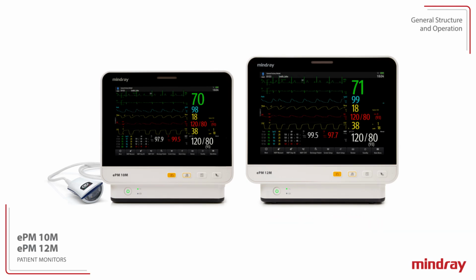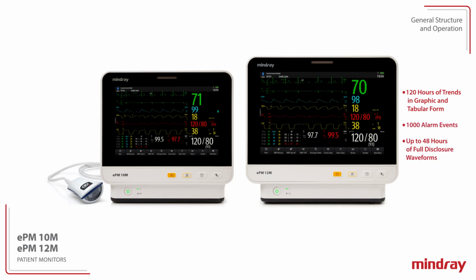The ePM 10M and 12M patient monitors allow review of patient data, including 120 hours of trends in graphic and tabular form, 1,000 alarm events, and up to 48 hours of full disclosure waveforms.